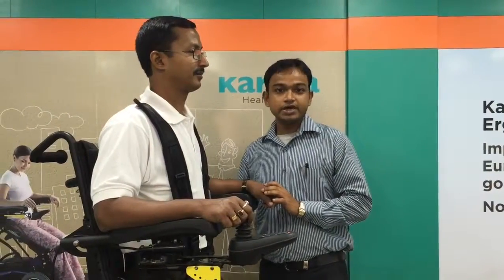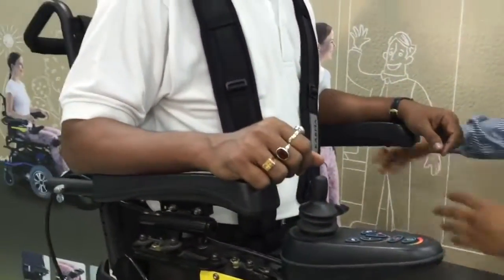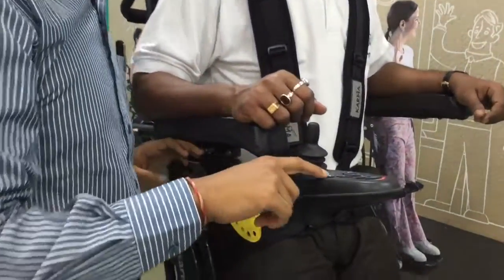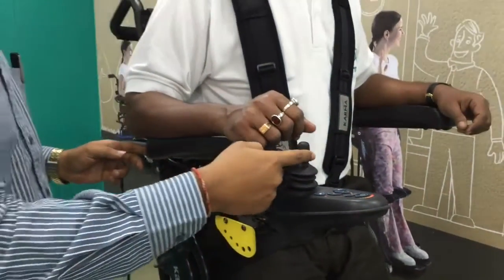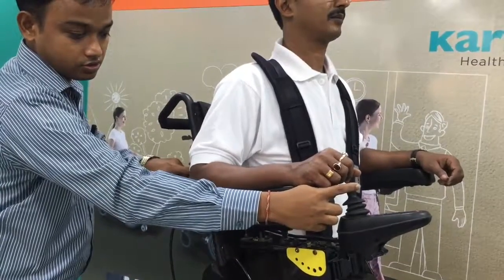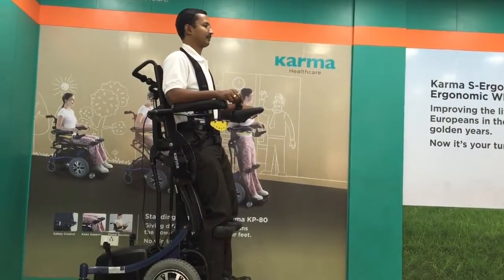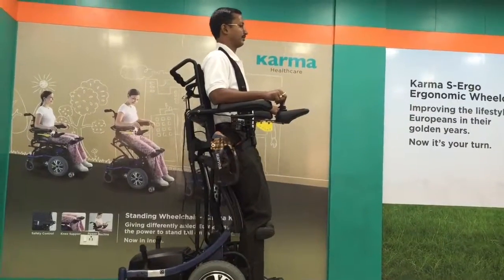After reaching the standing mode, another option available in the KP80 is the Recline function, where you can change your back position. It is currently at 90 degrees and you can change the back position up to 120 degrees. Press the recline button and move the joystick knob backward — you will notice the back position is changing. You can adjust this position according to your suitability. In the standing position, you can also move the wheelchair forward and backward the same way as in sitting mode.